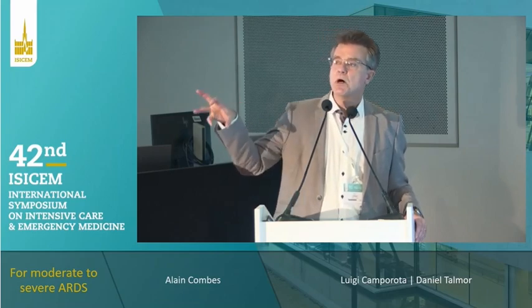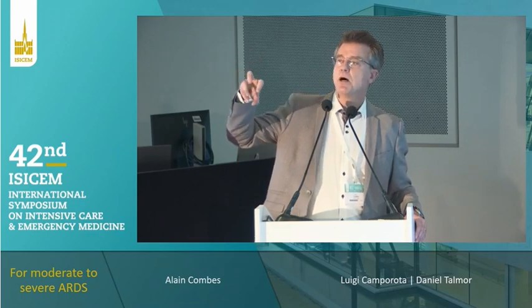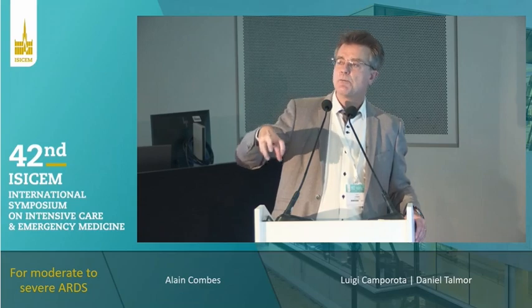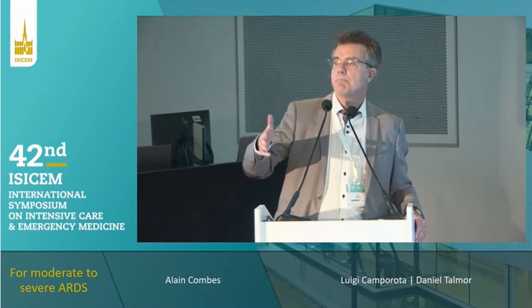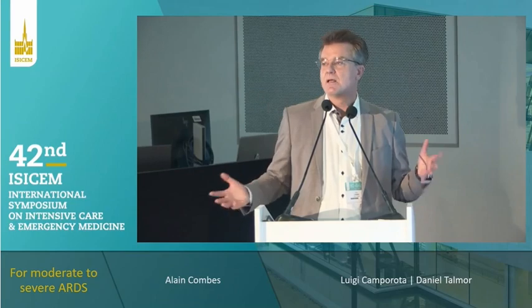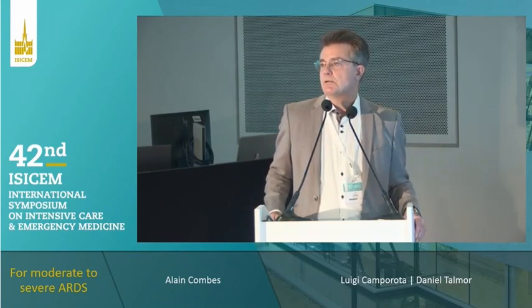Together with some hemolysis also, which has been demonstrated, if you are using ECMO centrifugal pumps running at lower blood flows. ECMO pumps are made to propel the blood at above 3 liters per minute. And if you use that pump at 1.5 liters per minute, there might also be some hemolysis. Those are the problems of those small machines for now.